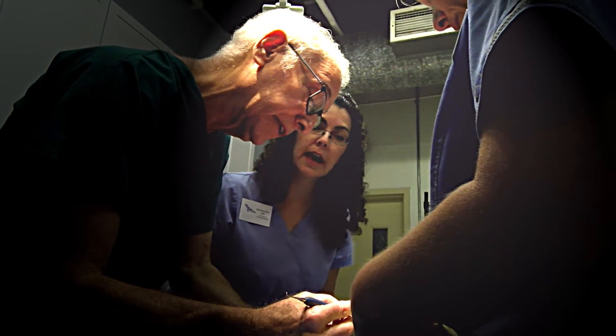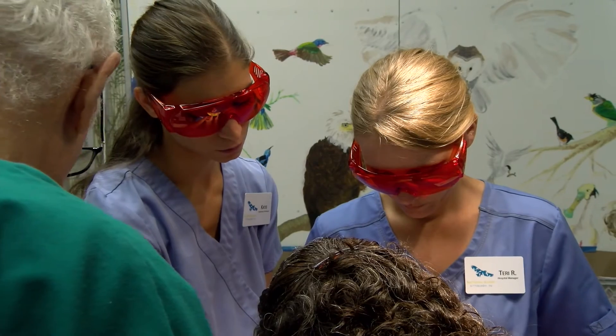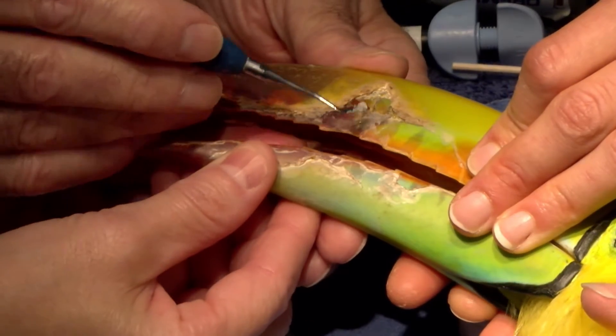I can see the crack right here. A dental composite resin is then molded and pressed into the cracks and fissures of the beak.